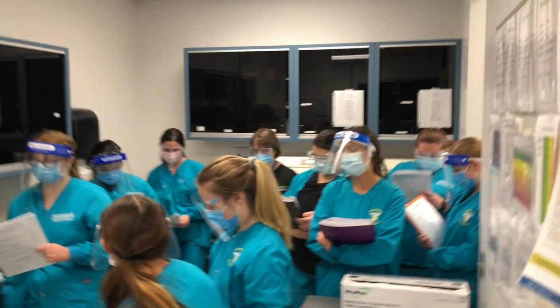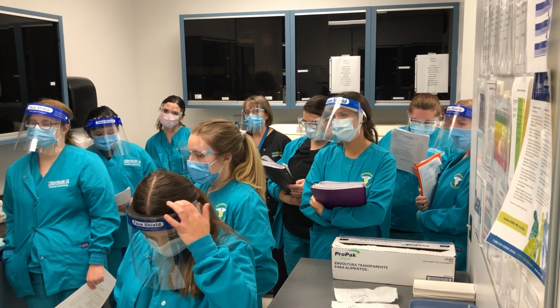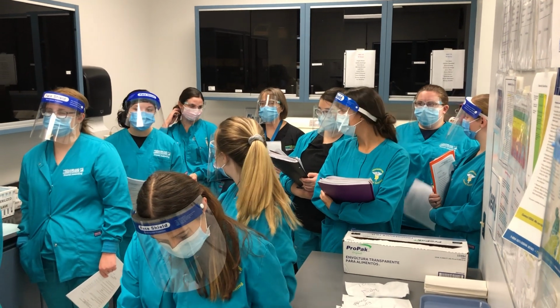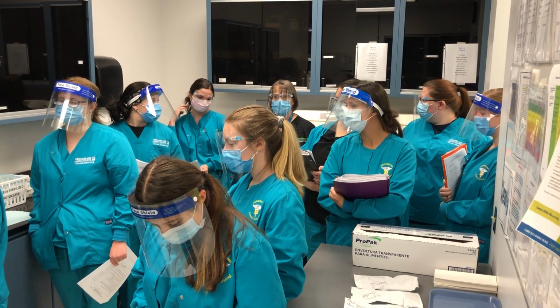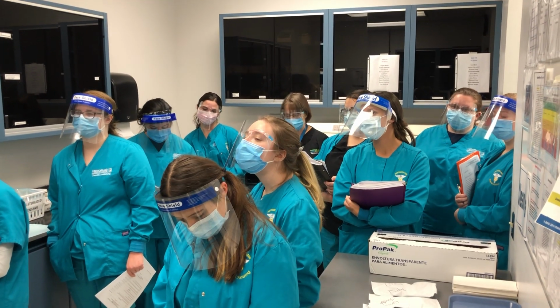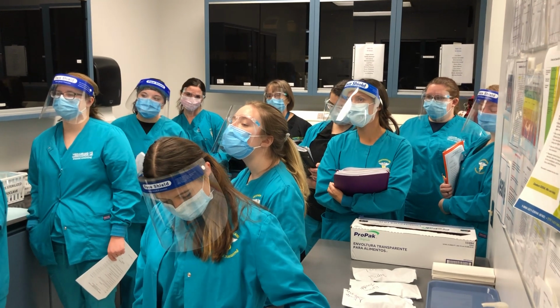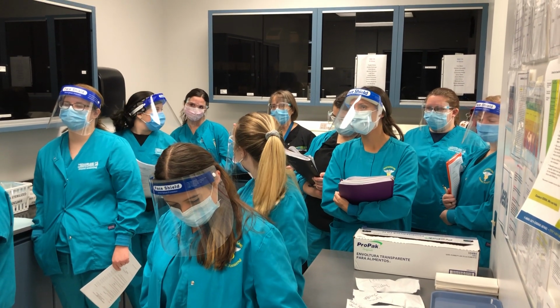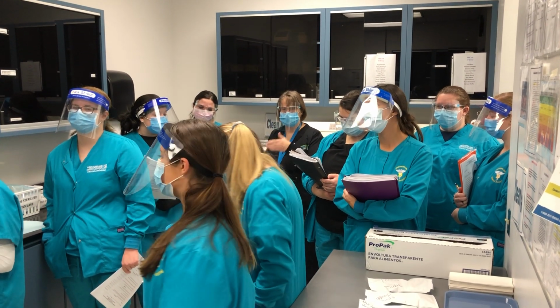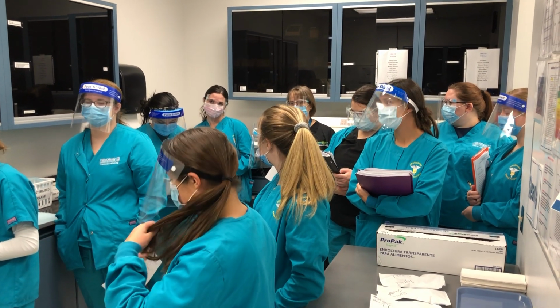So after the cassette is dry, you want to wrap the cassette with the appropriate disposables. Okay? And again, it would be whatever the procedure is in your office. For us, we have certain things that are listed up there: the gauze, the tongue blade, the cotton tip applicator. And we also have something that we're checking for sterilization inside. So all of those are in the drawer.